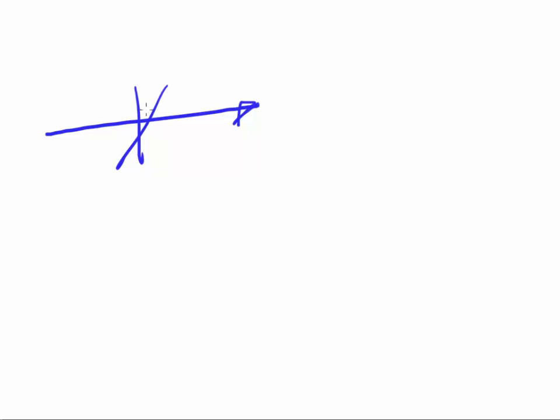So what do we do? Well, we add fluctuating or changing magnetic fields, much weaker than the main field, but one of them in the same direction as the main magnetic field, and the other two on the other two axes. The purpose of this is so that we can change the field so it's slightly weaker on one side and slightly greater on the other side. Again, the precession depends on this resonance.